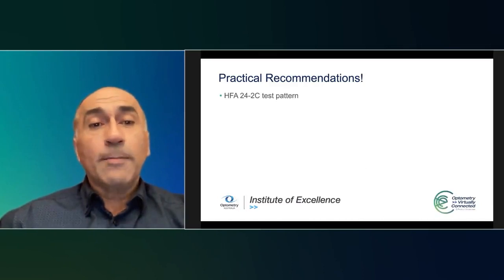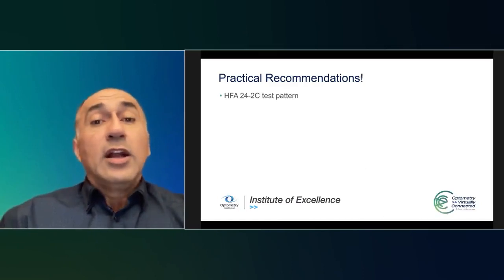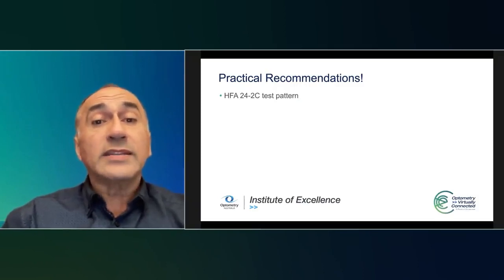So let's finish with some practical recommendations. I'd suggest for most patients you see, use the 24-2C test pattern.